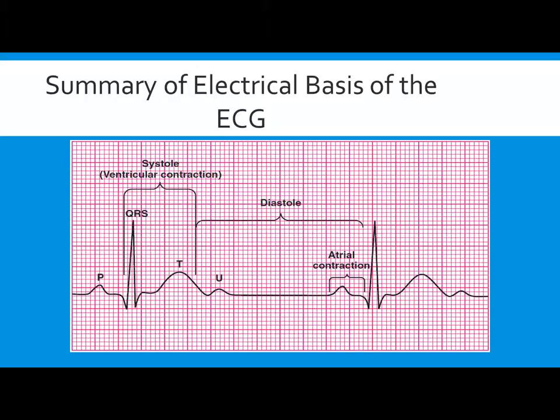Next thing I'm going to look at, my QRS. So if I start here, 1, 2, 3, 4, 4 times 0.04, 0.16, so we're already 0 for 2, right? It's got to be less than 0.12, okay? I'm just showing you this on here, and I don't know why they put that up there and it not be normal, but it's not.